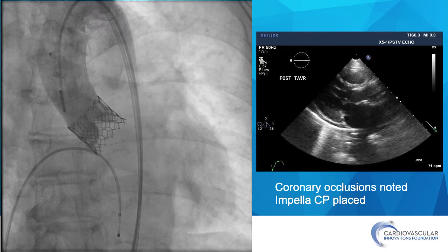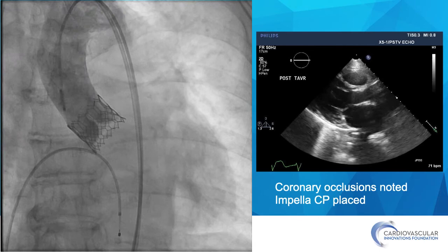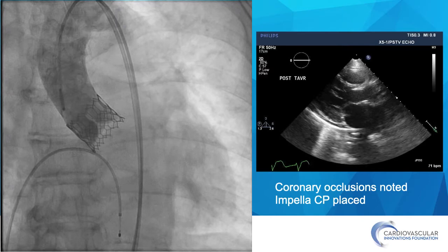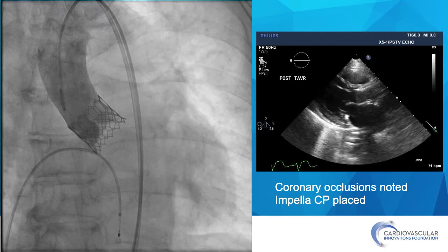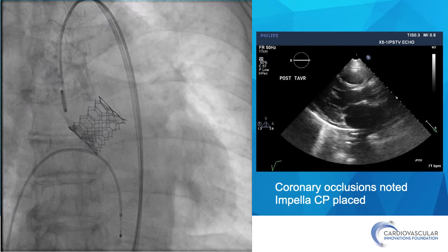Our first move was to do an angiogram of the ascending aorta. You can see immediately that cardiac output is very low, and on the angiogram there is no filling of the coronary arteries — neither the right nor the left. The surface echo shows very poor left ventricular function and no pericardial effusion. The patient was hemodynamically unstable, so our first maneuver was to place an Impella-CP and plan on intervening on the occluded coronary arteries.